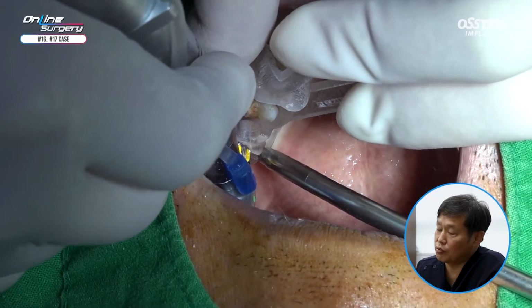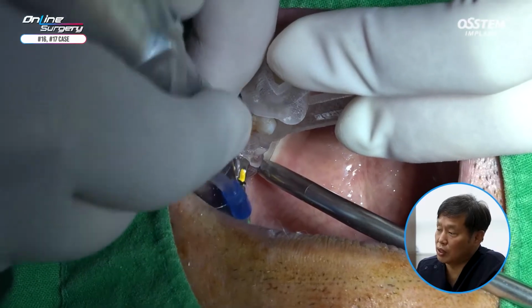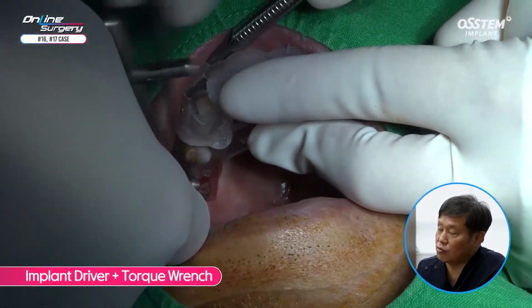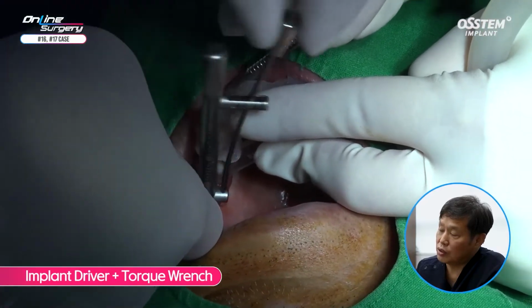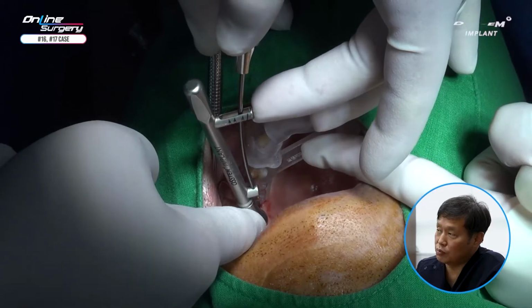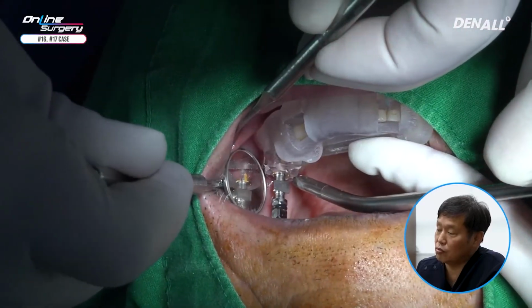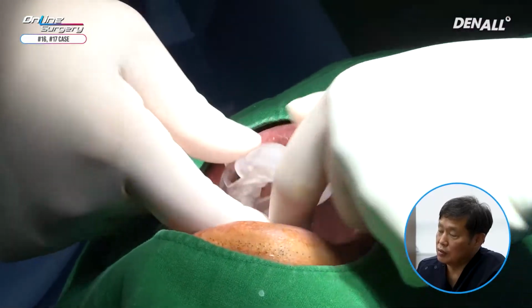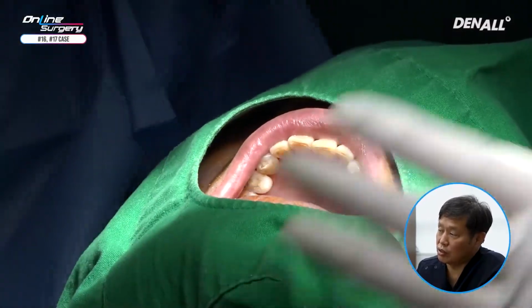I think the bone is less hard here. The final drill was done up to 3.8 and the implant is placed. A torque ratchet implant driver is used to get the final implant position. It's slightly less than 30 Newton centimeters. Yellow marking and the triangle are utilized.